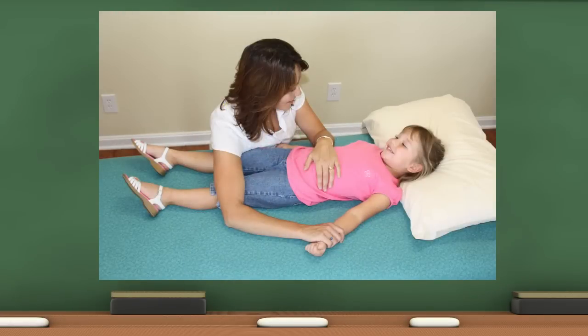For inpatients or for outpatient situations where laying the child down is preferred, recline the patient on a bed or cot with the parent or other assistant providing gentle restraint to the legs, the free arm, and to the wrist of the arm to be punctured. Support under the elbow is important too.